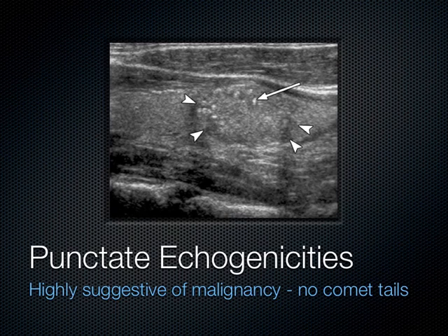Now, sometimes in these nodules, you'll see some punctate echogenicities, and what you want to wonder to yourself is, is there a cancer there or not? And it depends on if there's comet tails.